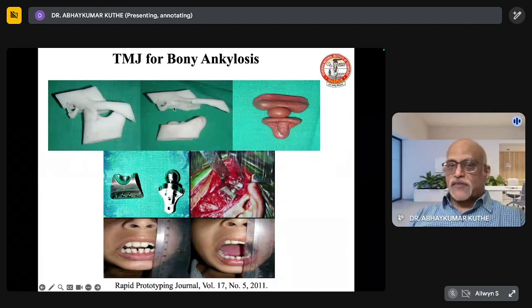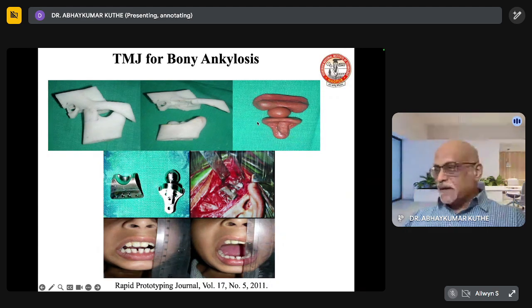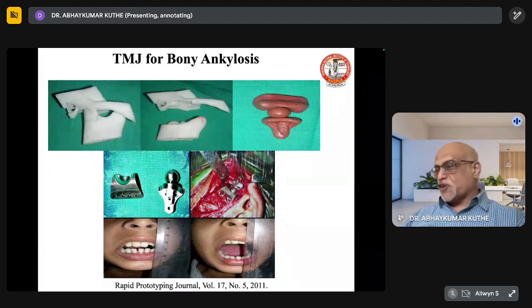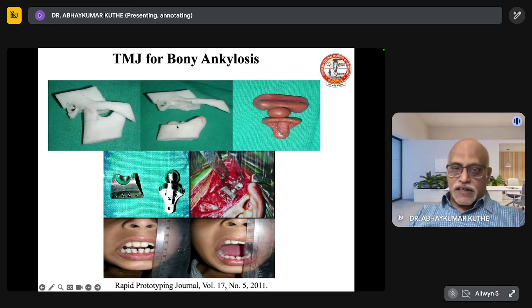then ultimately myself and the doctors started interacting about what type of joint we should first develop. You can see here, we have used the clay model to set the form of the part. This is what we generally call the concept, because the doctors will have a major role to play in that. And he is very comfortable using clay. So then we reverse engineered it, got the 3D printed model, again got the permutation and combination done of that particular product, finally manufactured this metallic implant, and fitted it into the patient's body.